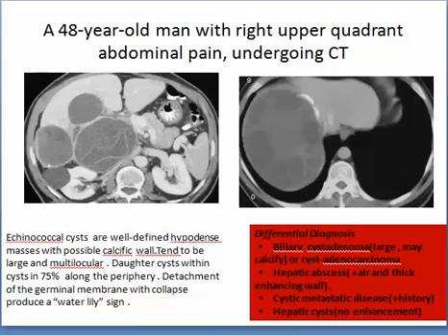In biliary cystadenoma, we said that they are large, may calcify, but the main point is the presence of soft tissue thickening inside, thick septa, mural nodules, focal bulge of the cysts.